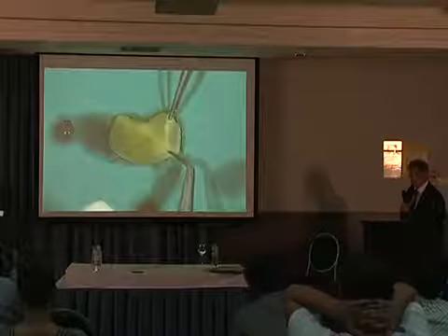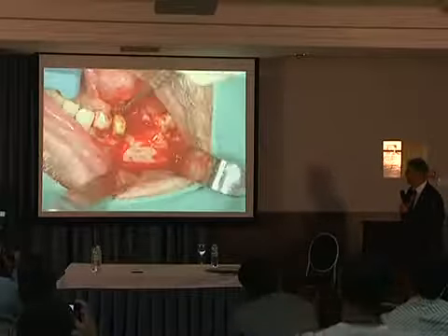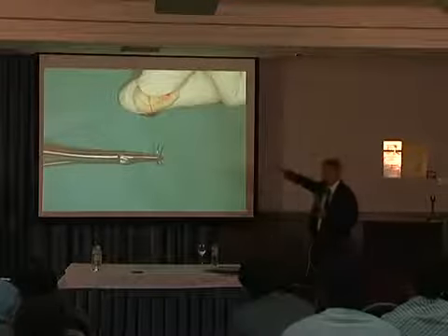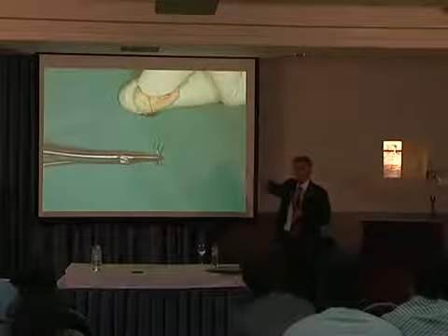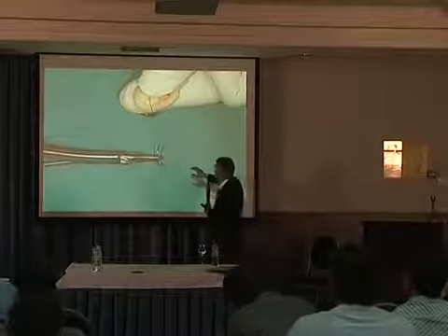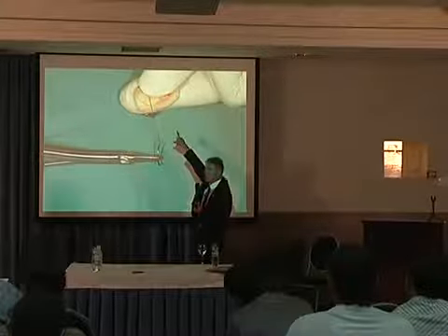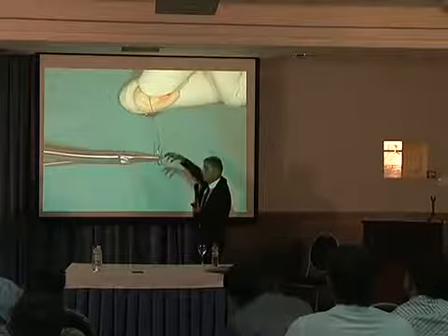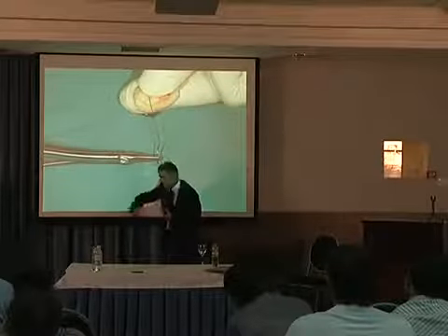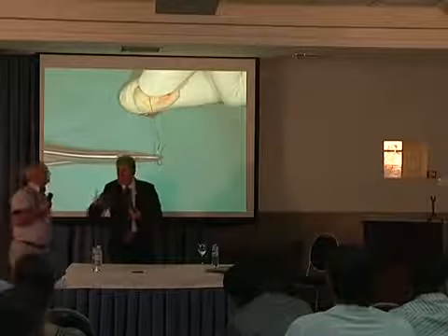The membrane, a fibrin membrane. Fixation under the periosteum. And this is a resorbable suture material. You must have a resorbable one because you cannot remove these stitches anymore. This is Vicryl, and this cotton is dipped in some PRGF, and when you pass the suture through it, even also in saline, it's not so adhesive to the blood. It goes much easier through the tissue.